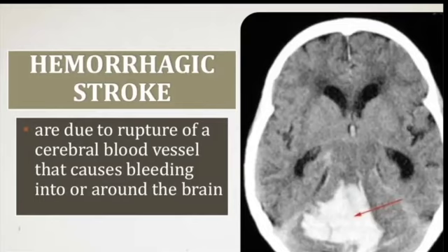Well, I'm going to behave as if this is an ischemic stroke, because an ischemic stroke can appear normal on a CT. So this is the main purpose of a CT whenever you see a patient with a stroke. If the patient's physical examination and history confirm a stroke, we're using a CT to differentiate whether this is an ischemic stroke or a hemorrhagic stroke. We're not using it to disqualify strokes from the whole differential. Strokes are still on the differential, but you're doing a CT just to see whether this is a hemorrhagic stroke or an ischemic stroke.